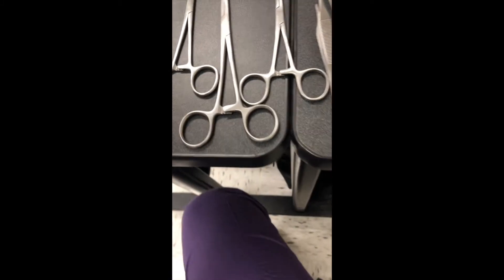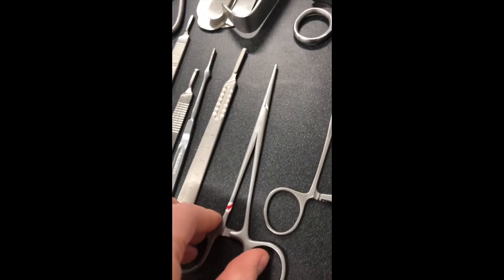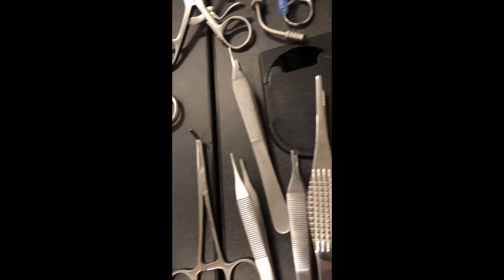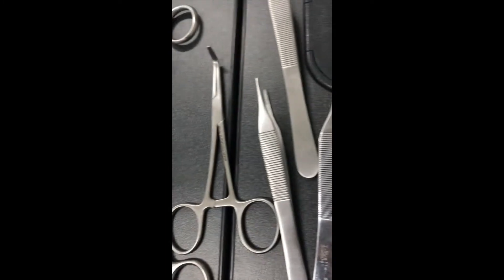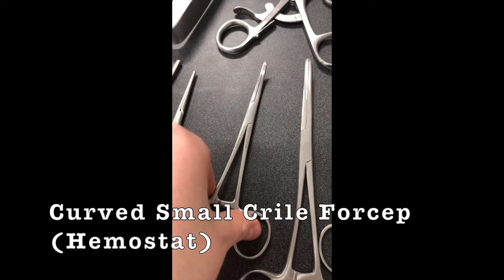And then you've got Halstead. Okay, so — Kelly or Halstead? I'm staying out of this. So yeah, that's the hemostat. And then, was this one supposed to be the small Crile, the curved Crile? Okay, that one's the curved small Crile.